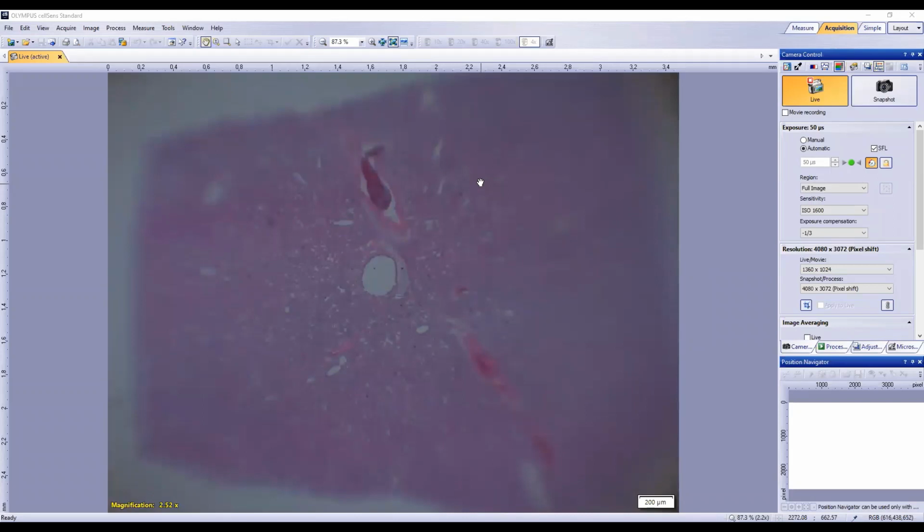Yeah, excellent. Now, Emily, Veronique, and Mehmet all picked liver, and looking at this, absolutely. So maybe, Madison, unmute yourself. Let us know why you would have picked liver for this one. It just looks so dense and, I don't know, just looks liverish, I guess. Yeah, absolutely. So what is it about the architecture of liver that this is suggesting?